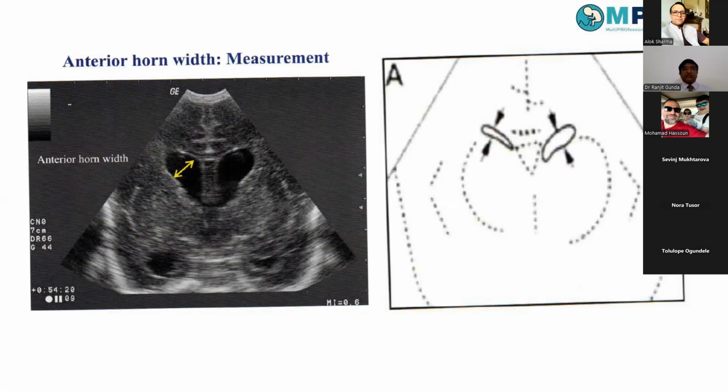But if it's a congenital hydrocephalus, probably you might not see the slow progression. You might directly see a baby with big ventricles because there might be a congenital anomaly associated with it. But these measurements and serial measurements will be more useful for us for the posthemorrhagic or progressive ventricular dilatation, because of either hemorrhage or infective pathology that we'll see.